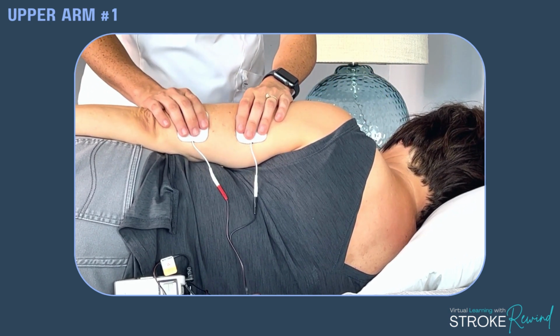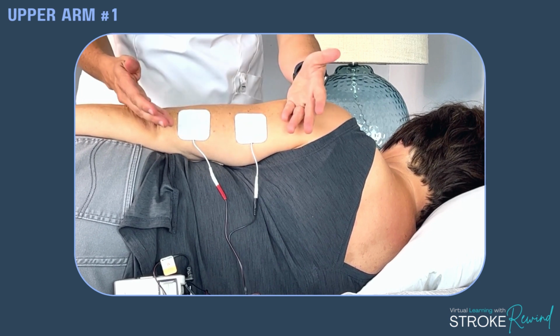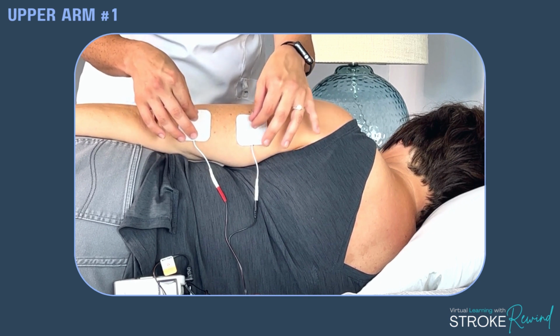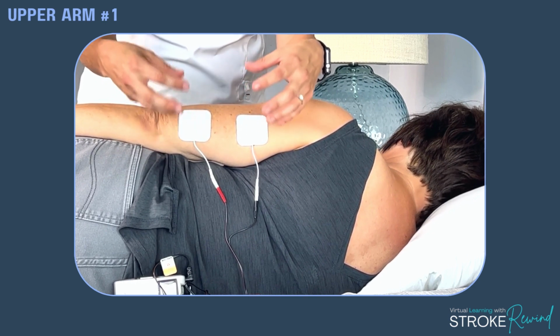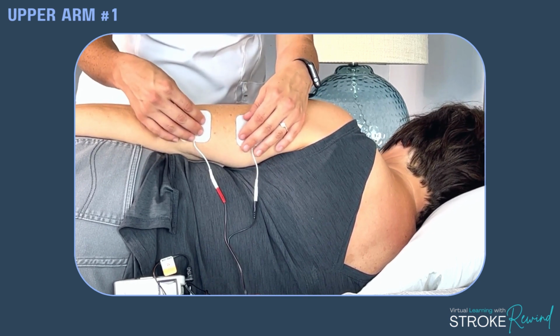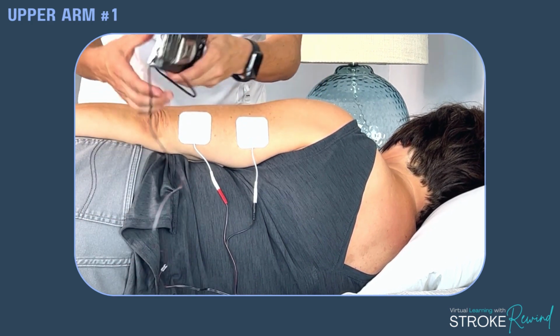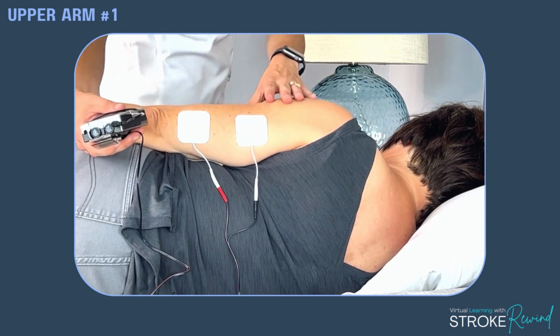Don't forget too, if you don't like your placement, turn off the machine and place it somewhere else. And another trick is if you do a little pen mark or a marker, you can actually mark where you get the most movement with the electrodes in the muscle, so you can place that on there as often as you want and accurately.